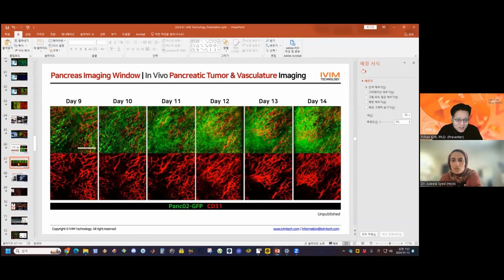In our microscope, we first start with the low magnification objective lens to identify where to look. We identify the big vessel as our anatomical landmark, and then we follow it. We use the very big vessel as our landmark to find the microscopy location. Then we change from the low magnification objective lens to the high magnification objective lens, and we are able to find the exact same location, like this, shown in this slide.